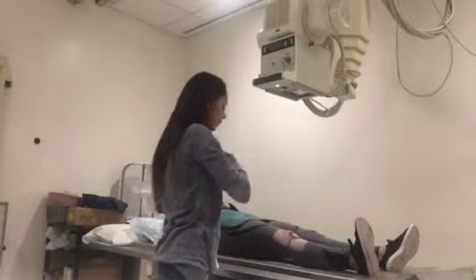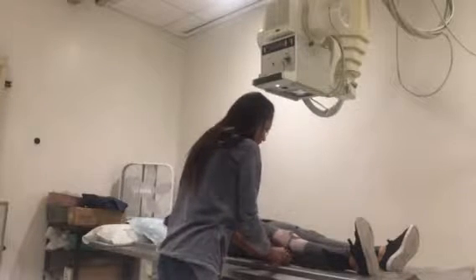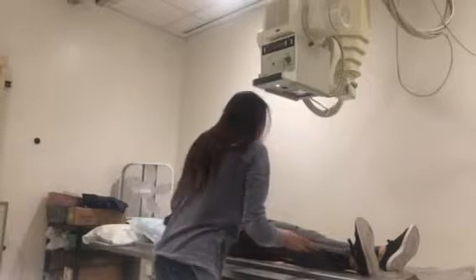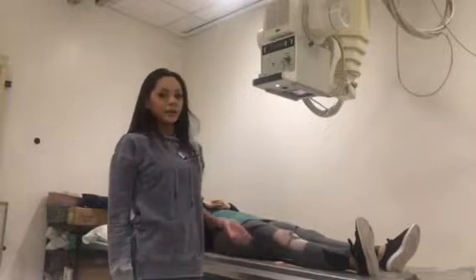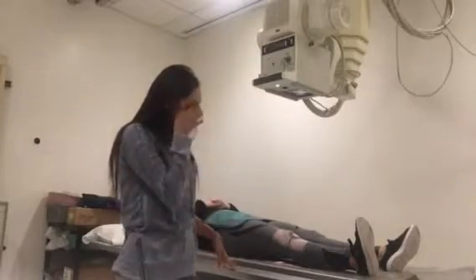And I'm going to go ahead and put my marker there. And a technique that I would use would probably be about 80 at about 10.